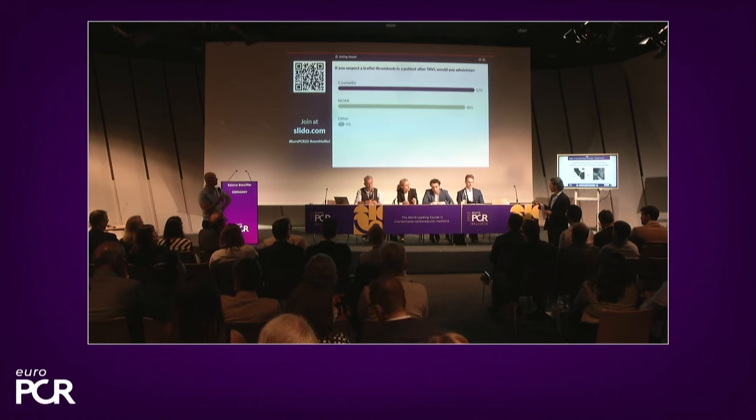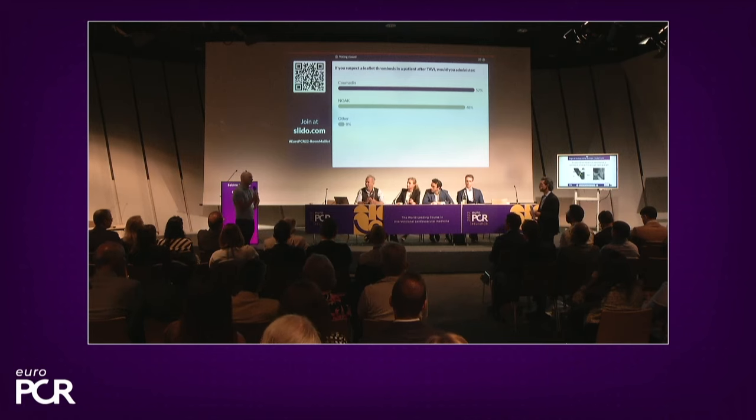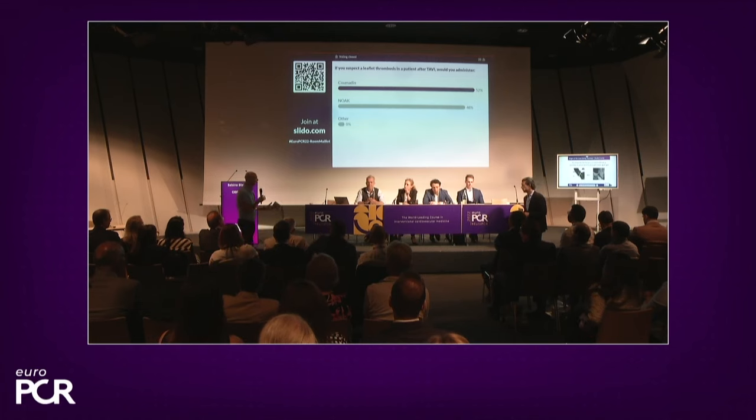Okay, so the radiotracer that is. But also the group around Bing et al., who were co-authors in the Jack paper, are using that. But there is radiation involved, right? Right, yeah, so you always have to be cautious about that. But I think it's also fair to say that systematic CT follow-up after a TAVI is a no-go. You should not implement that. We only used it in clinically symptomatic patients.